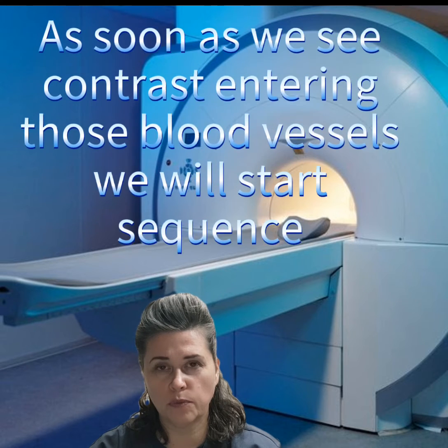So we connect the power injector to the patient, and we explain to the patient what is going to happen. It is very important. We do not want to scan too early. We don't want to scan too late. We also have to time the injection at least 2 milliliters per second. If it's 1 milliliter, it's not going to give us what we want, good images.